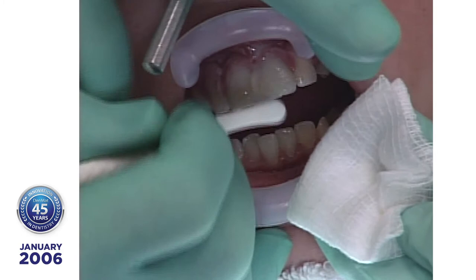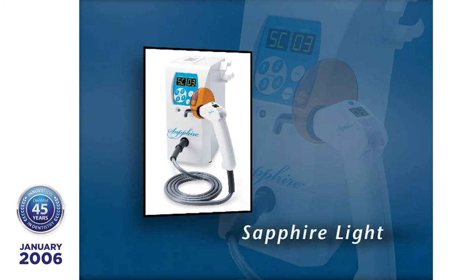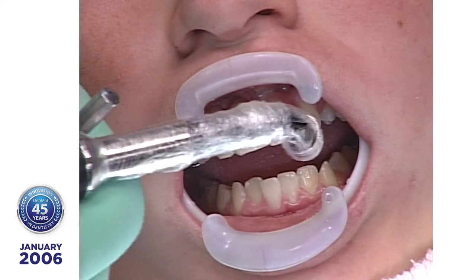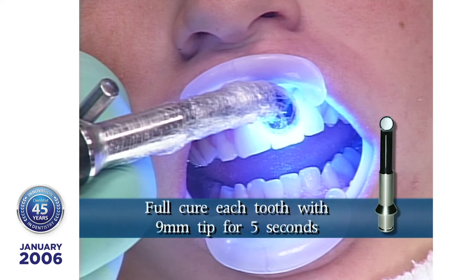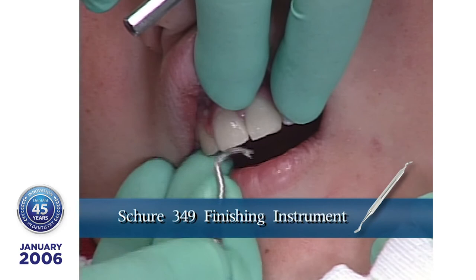Using this tack and cleanup technique will reduce finishing time by 50%. Full cure is achieved with the Sapphire Light and the 9mm curing tip for 5 seconds per tooth. The cured composite resin on the lumineer's surface is easily removed using a Schure 349 instrument, which will not damage the porcelain glaze. Do not use a hygienist's scaling instrument, as it will scratch the porcelain.